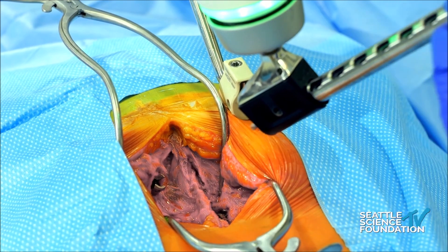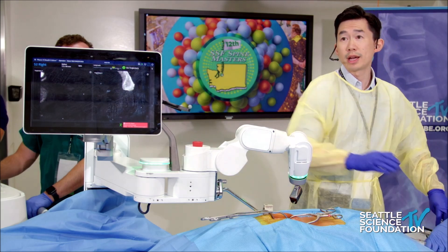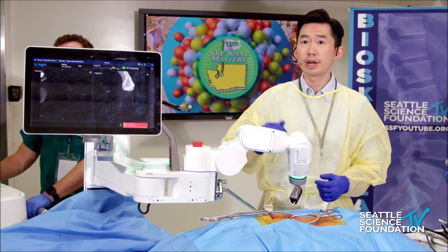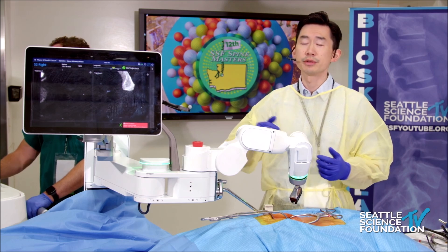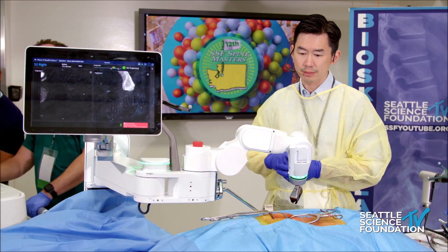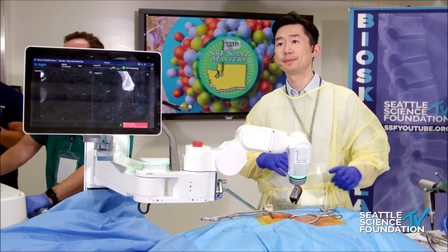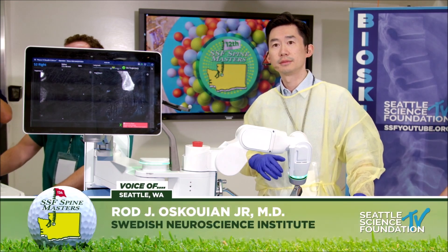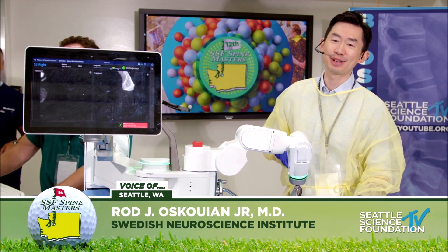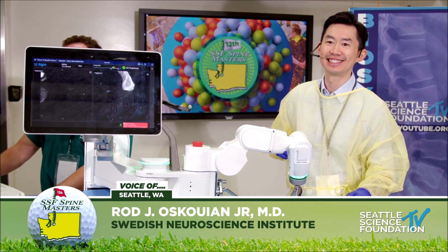And that is essentially it. As I showed through some of my cases, this is just one S2AI screw. If you're doing a very complex revision, you can put in two or three S2AI screws — it's purely in planning the robotic system to make sure you have space and that everything lines up with the rest of your deformity. Martin, I think that took three minutes. I was talking too much. It's my fatal flaw in the OR.